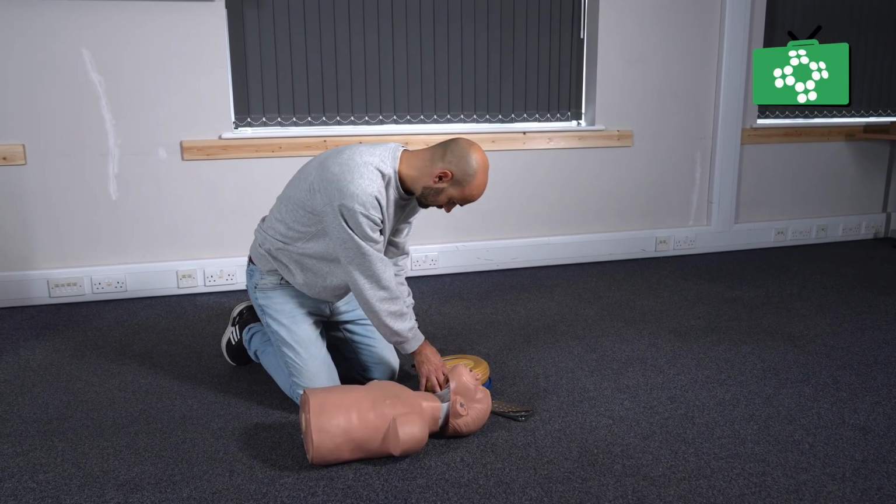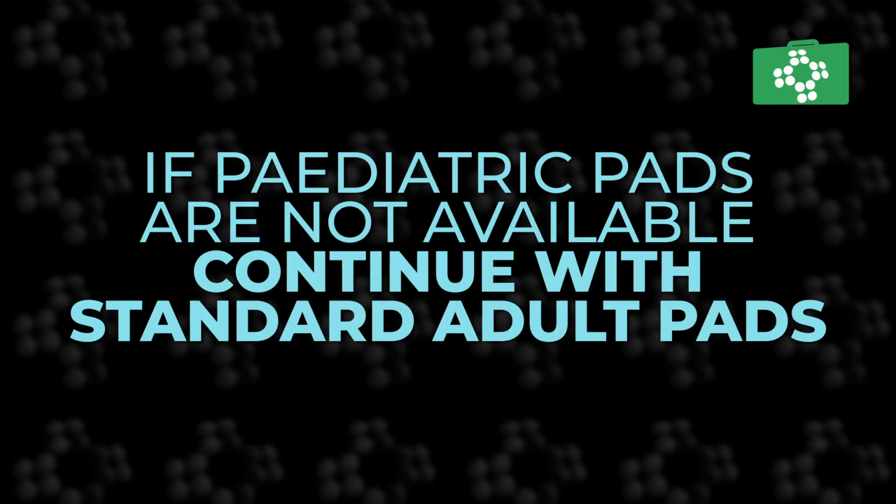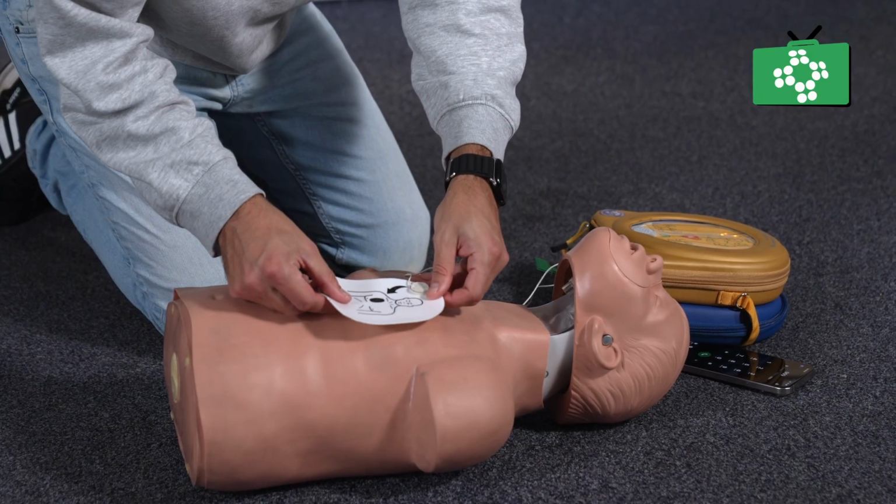If the AED has a paediatric mode or paediatric pads, use them. They reduce the shock energy to a level suitable for smaller bodies. If paediatric pads or modes are not available, use the adult settings. Never delay defibrillation.